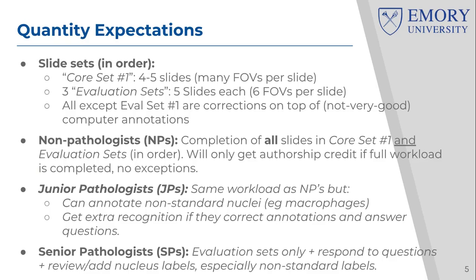So what do we expect in terms of quantity from members in this project? There are two types of slide sets. There's what we call the core set, which is basically 4 to 5 slides containing many fields of view. FOV stands for field of view, which is basically a very small area that you can annotate.